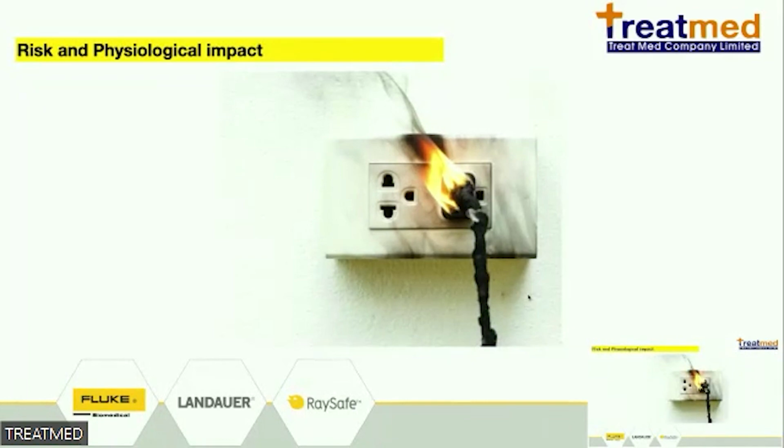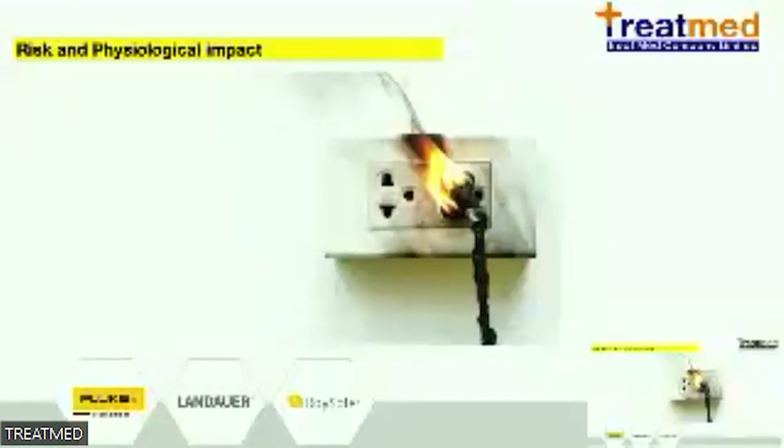This is a risk factor for electrical safety. In the picture you can see the power cord is damaged. It can burn, and the electricity in the wall can short and burn. This is not safe. We do not recommend using this power cord.